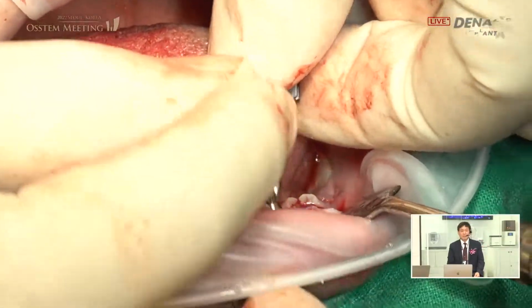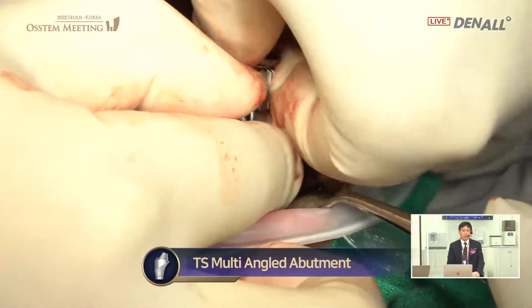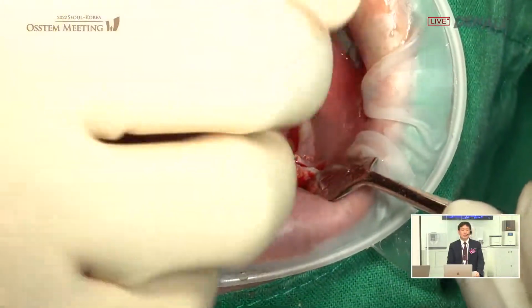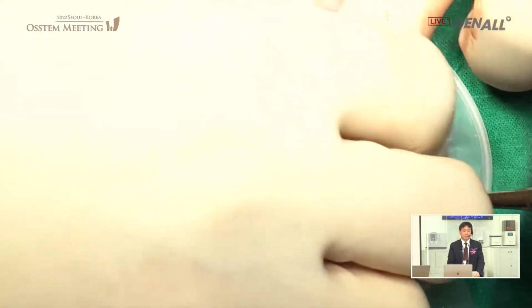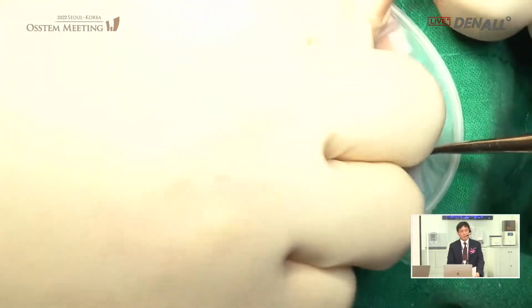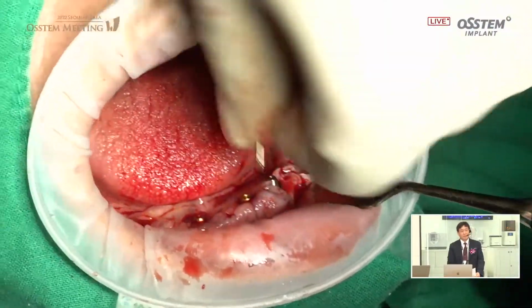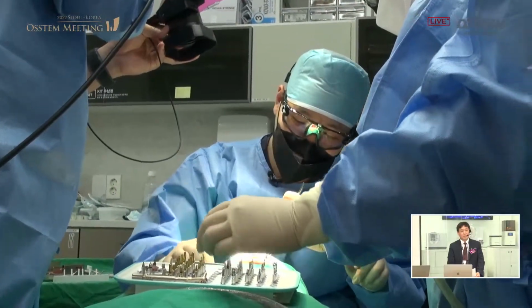The multi-angled abutment is not being connected yet. Now he's connecting it. You need to be careful in this area. This is the most tricky area of the entire surgery. The handle is removed.